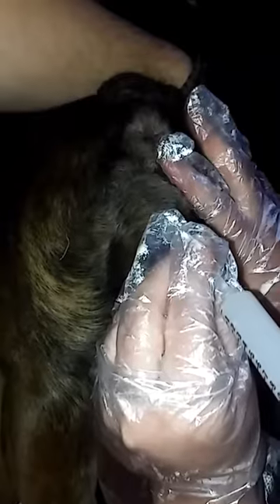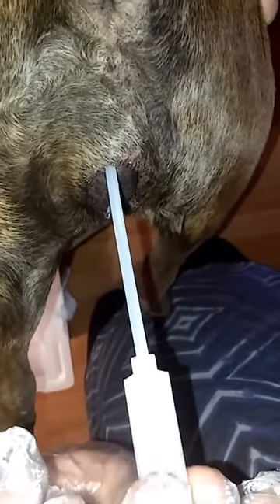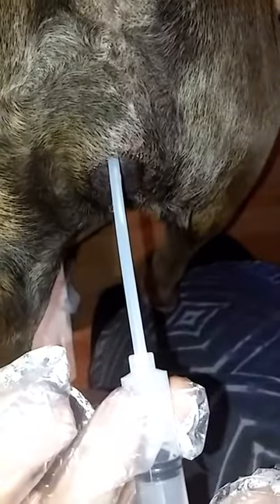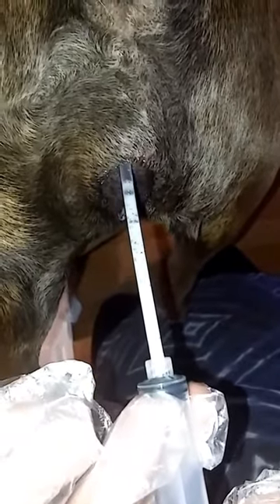So now I'm at the end there, and you don't want it to squirt out. Once you've hit that, you're going to pull back just a touch. Then go ahead and just push it down. This is a really important part — do not pull it out right now. Once it's down there, you're going to pull this right off.